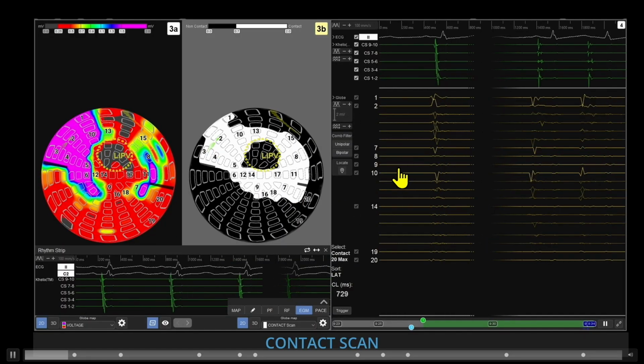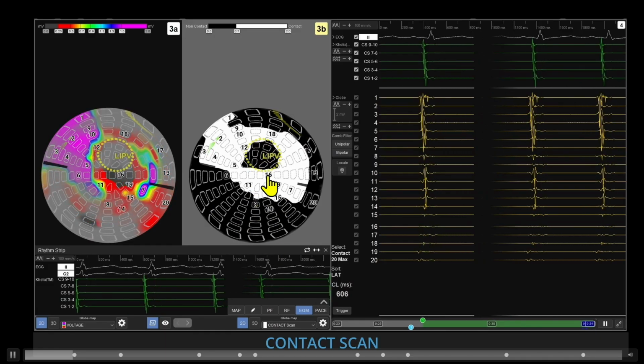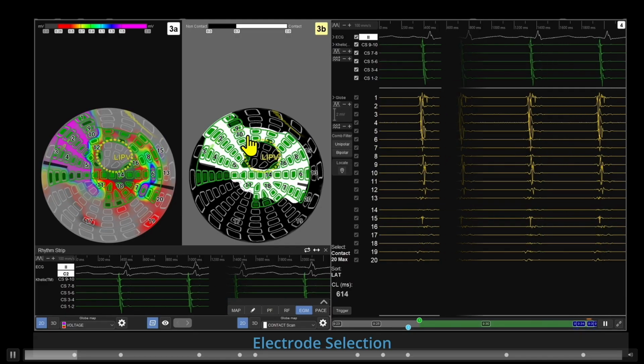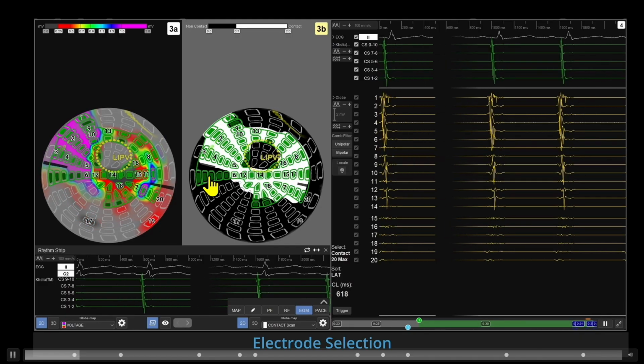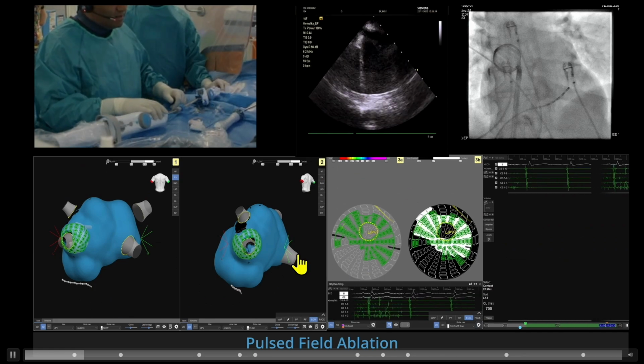In this case, you can also have electrograms, and we're going to run a contact scan. I think this is up against, well, it says right here, left inferior pulmonary vein. There you have the electrodes, then you can select this, and at this point the operator can deselect electrodes or select additional electrodes and then start delivering energy.